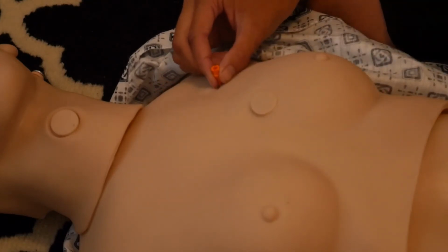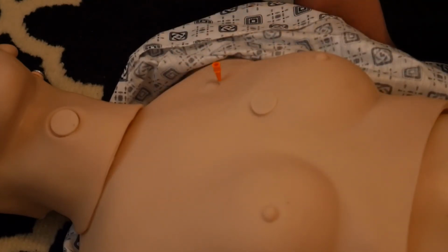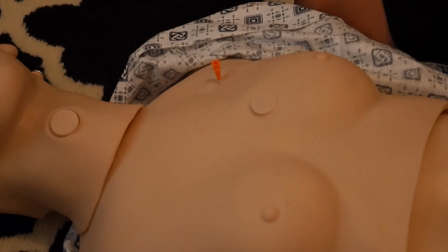So at this point, you would want to look for improvement. If there is improvement, then you want to just continue to monitor until paramedics get there, advanced personnel that can take the patient over for you. If there is no improvement, then you want to go ahead and attempt another needle decompression using the two other sites.